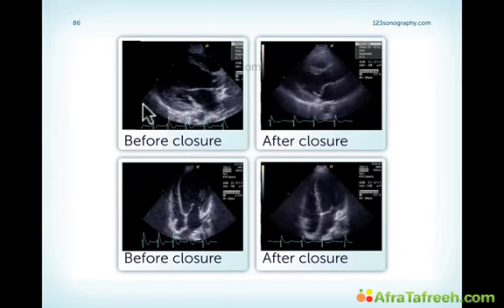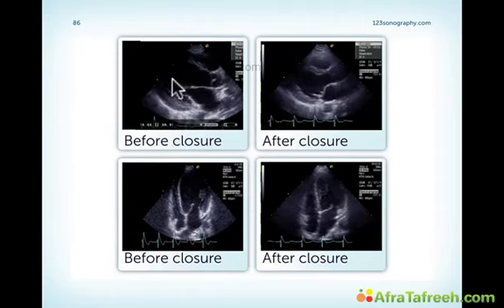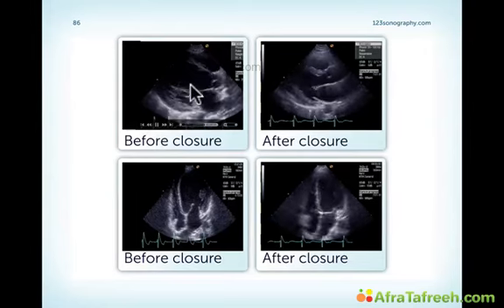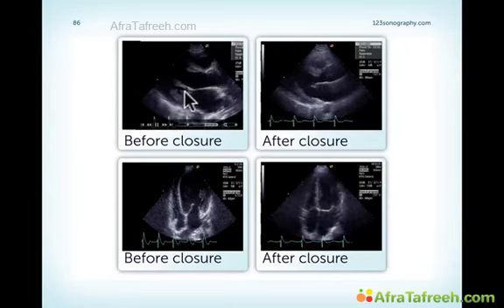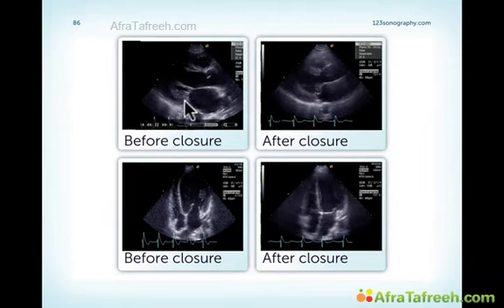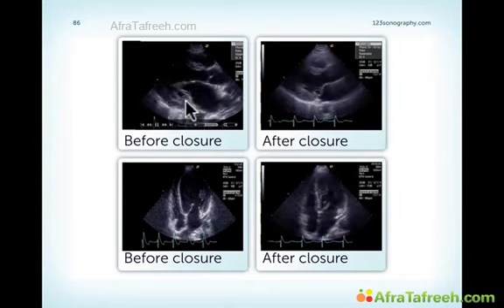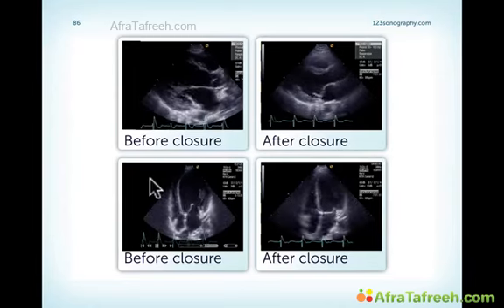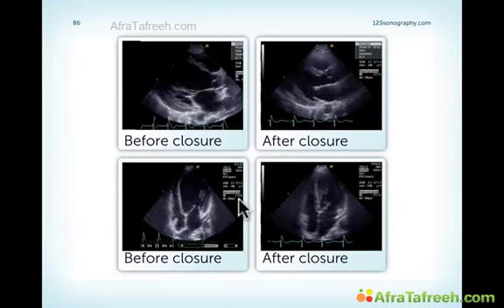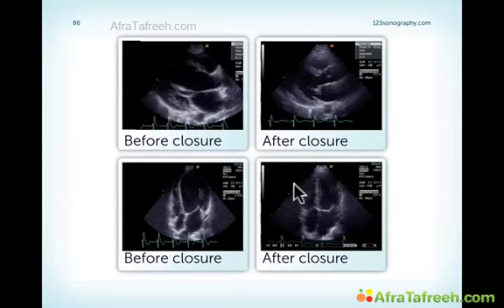This is a patient with a large left ventricle, and still, even the contractility may no longer be normal. We can appreciate that this is certainly a left ventricle with volume overload, a patient with a large PDA, and this patient, already adult, has not developed severe pulmonary hypertension and has primarily developed left heart failure. And these are the patients who can ideally be treated with PDA closure still in adult life.